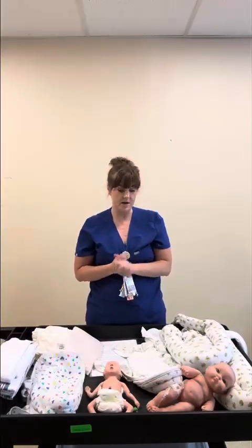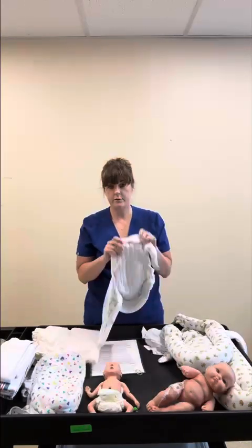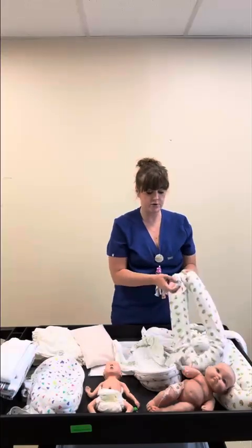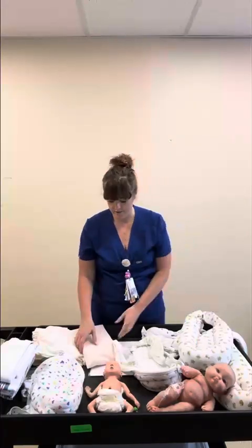We just are asking that you do not make your own homemade nests if at all possible. We realize sometimes supplies are limited. We are ordering more of the RU2s in the size medium, but if you find that you do not have a device at all, then you make your homemade nest. But hopefully you can strategically use what we have available.